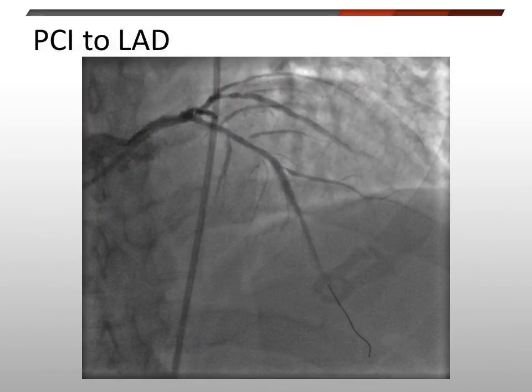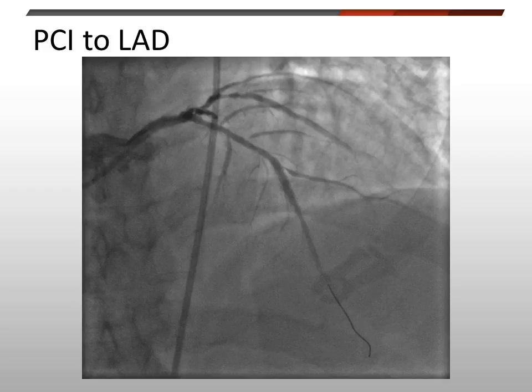The plan was to perform PCI to the LAD. The decision was whether to use a simple one-stent technique or commit to a more complex technique. I chose to perform a simple technique with stent implantation on the pressure wire already across the stenosis. A drug-eluting 2.5 by 12 mm stent was deployed in the LAD across the focal stenosis and across the diagonal 3 branch.